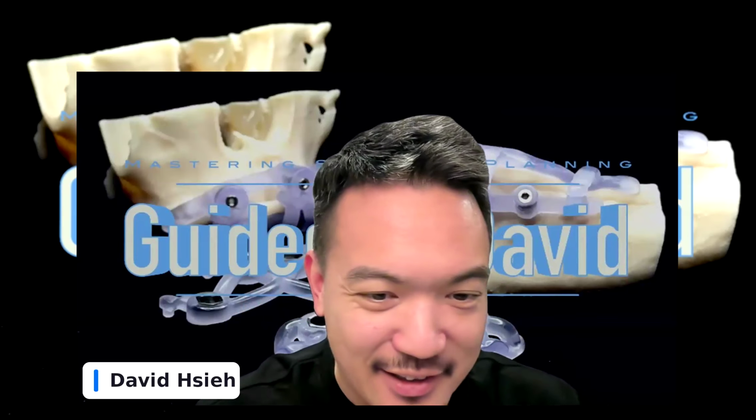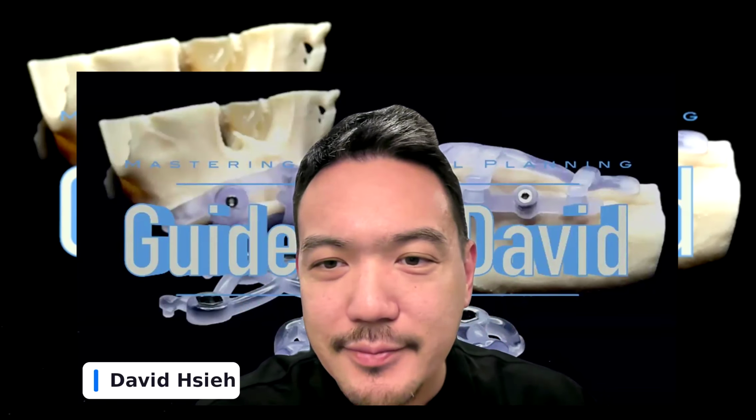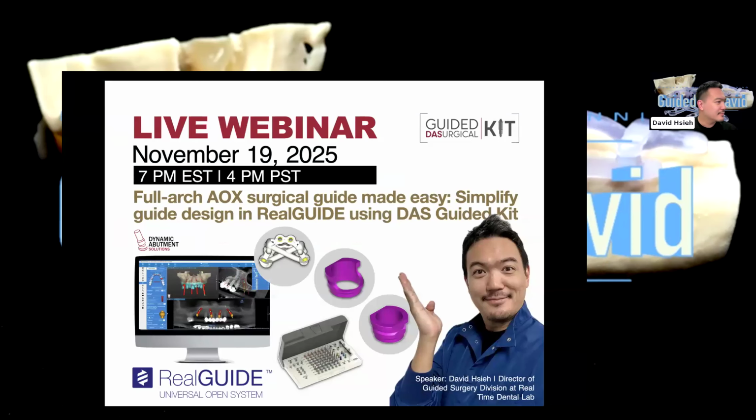So let me go ahead and share my screen right now. All right. I think we're good. Let me go ahead and change the setting here real quick.